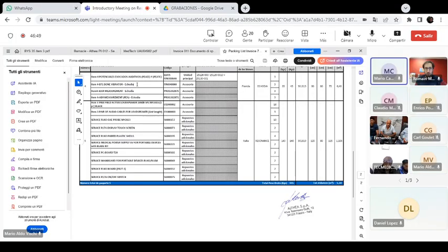In this case, it would be better to know this serial number in order to open a specific license for this device, because I'm assuming that usually all these options need to be specifically enabled for a specific serial number. So that's why I'm asking. Yeah, and so please confirm with us.